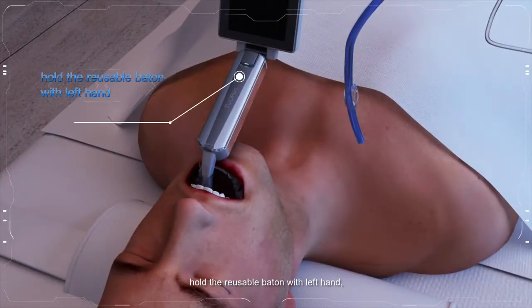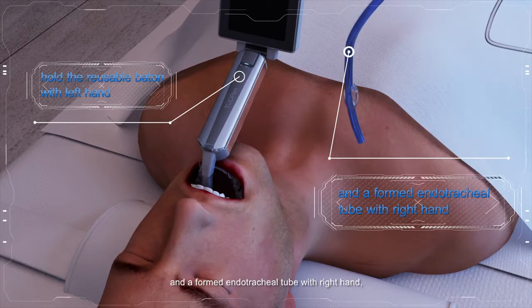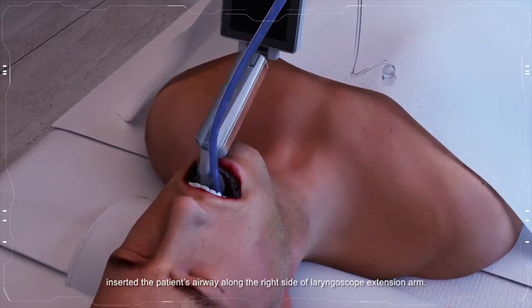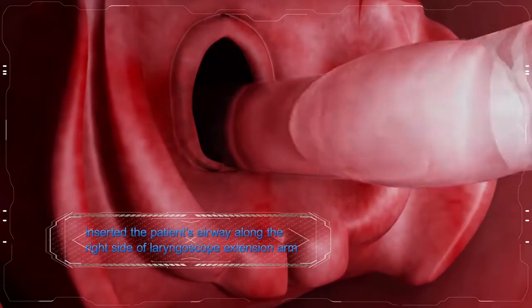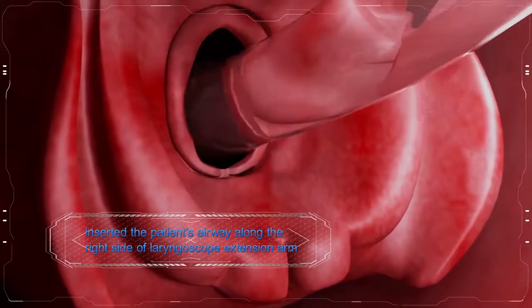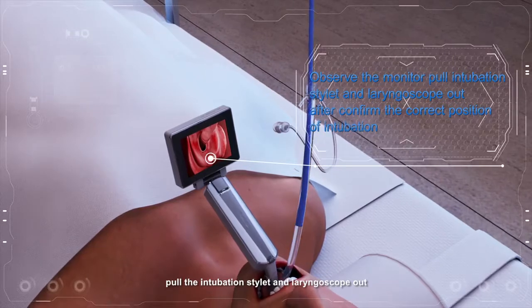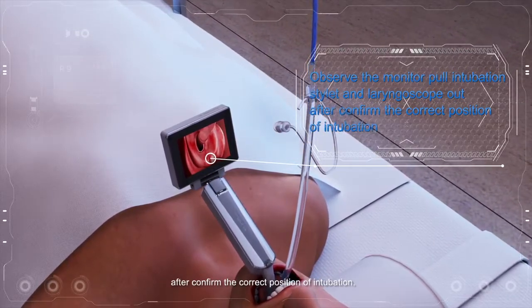Hold the reusable baton with the left hand and a formed endotracheal tube with the right hand. Insert it through the patient's airway along the right side of the laryngoscope extension arm. Observe the monitor, then pull the intubation stylet and laryngoscope out after confirming the correct position of intubation.